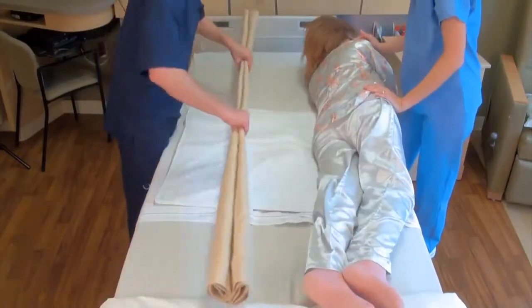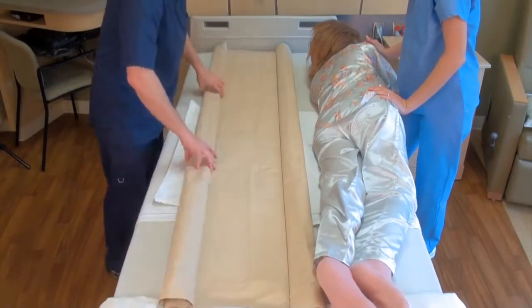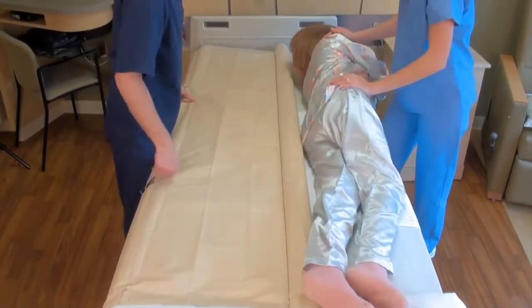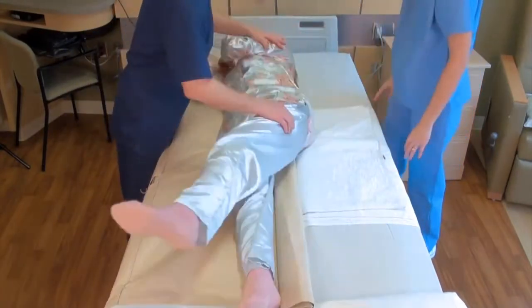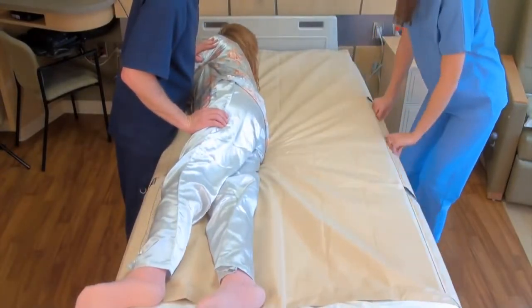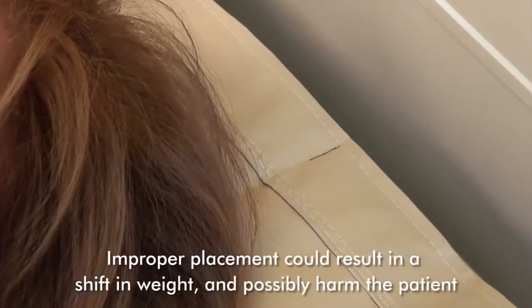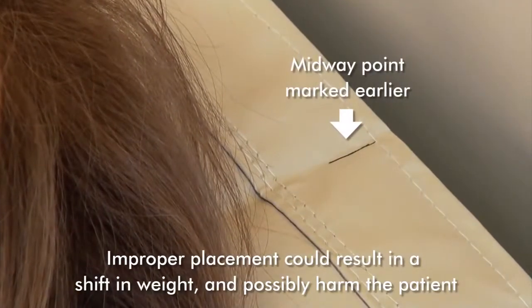Place the stretcher alongside the patient and work the stretcher underneath the patient by rolling them first to one side and then to the other, much like changing a bed sheet. The patient's weight must be centered along the length of the stretcher as much as possible so that when lifting they remain in a horizontal position. This is very important, as improper placement could result in a shift in weight and possibly harm the patient.